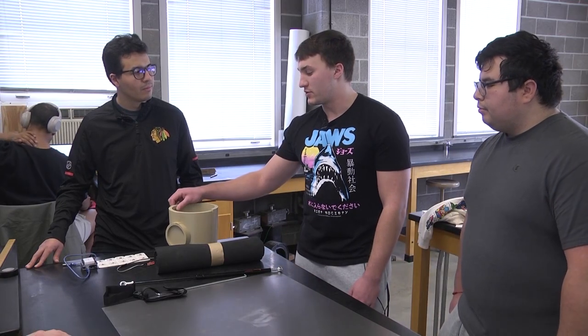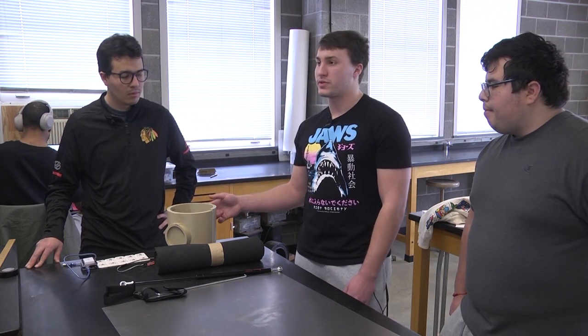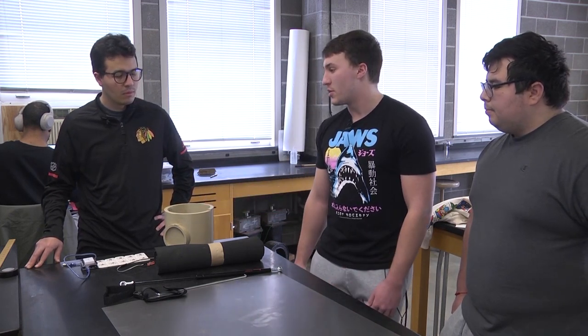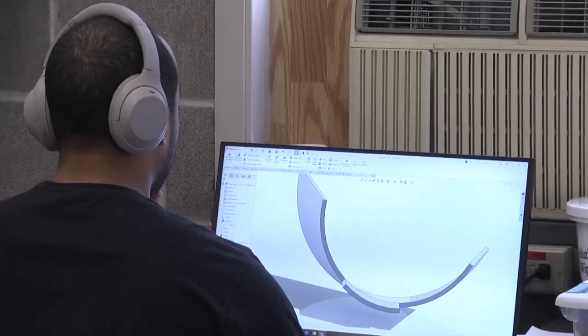This isn't the final version — this is just our first design. This is a 3D print for the top frame. There's also going to be a bottom frame, and I'm assuming that part is just made in a metal fabrication shop.